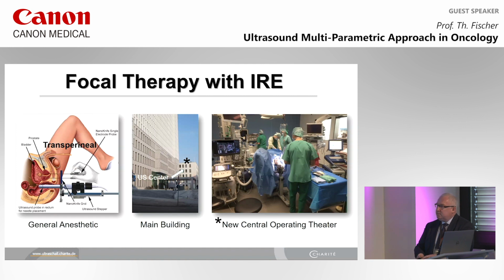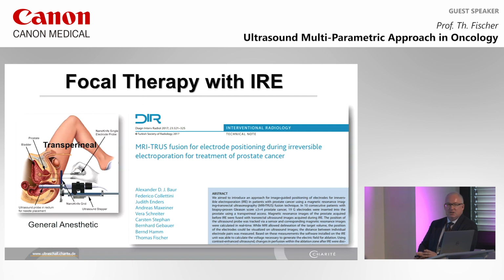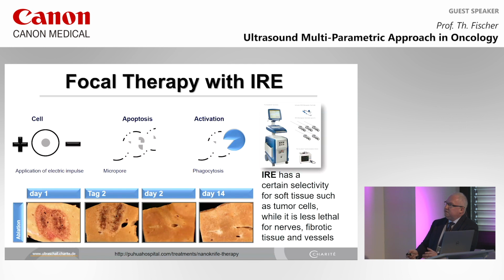In our department, we use the new central operation theater together with the urology department, and we use irreversible electroporation. This is a publication of the basic principle. If you like, you can read this paper. While we're focusing on this therapy, you can see here an example of an animal liver. On day 1 after therapy, it looks like a necrosis, but on day 14, there's absolutely nothing.